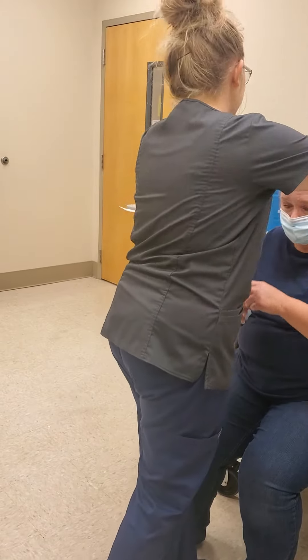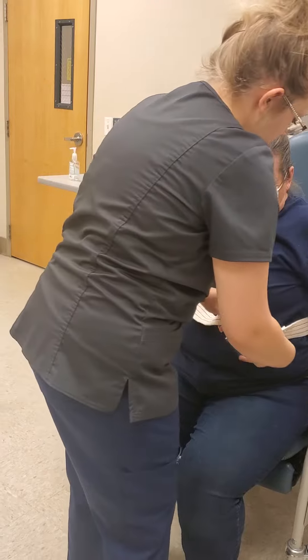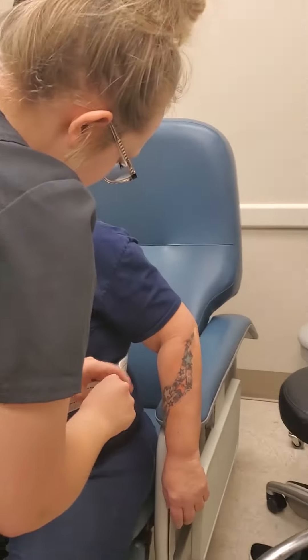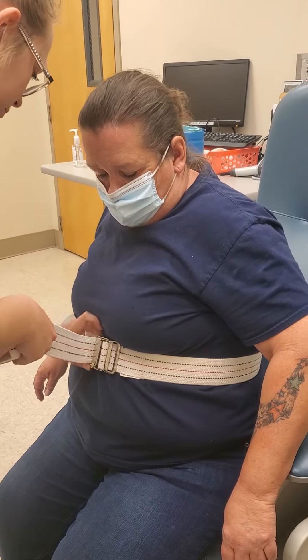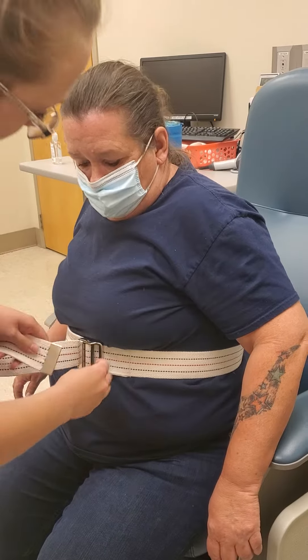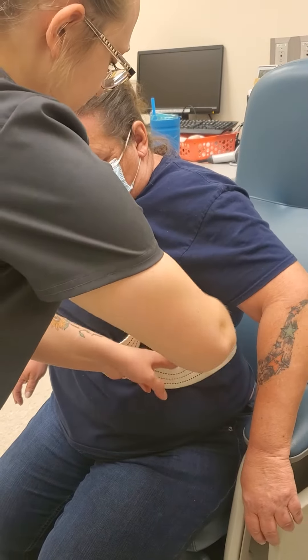I'm going to put this around you on your upper torso. I'm going to make it pretty snug. Okay, just put four fingers in there. I'm going to tuck this side in.